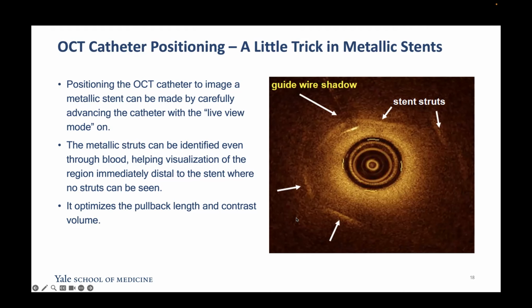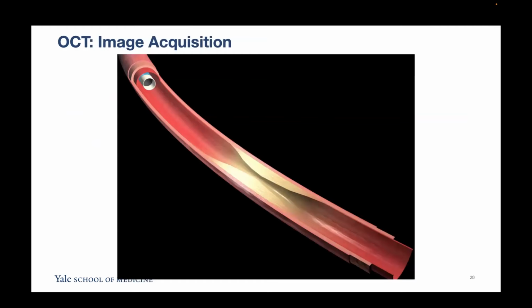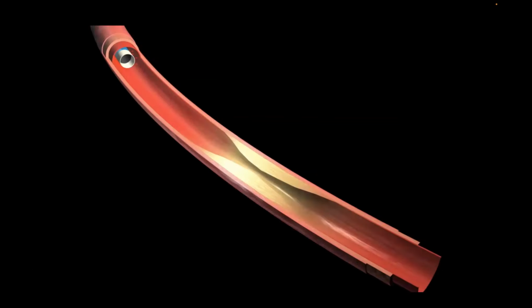Then I benefit from coming back to the guiding catheter, because your catheter is always going back and inside and out. So I always like to check the entire vessel proximally, because that is the segment where you have more manipulation than the distal segment. And you save contrast, because the more distal you go, the more time you need the contrast column filling the vessel. You have to inject a lot of contrast to fill it.